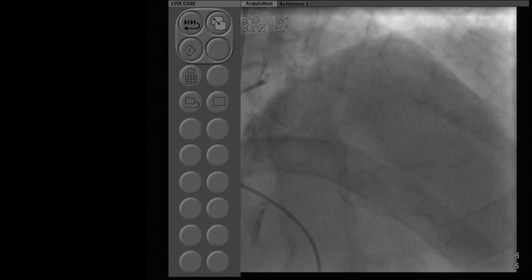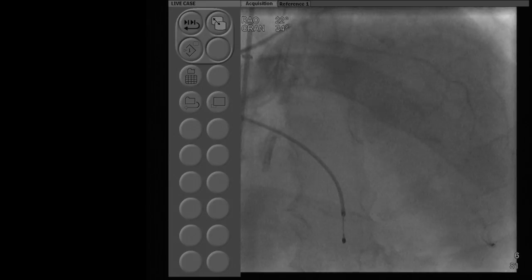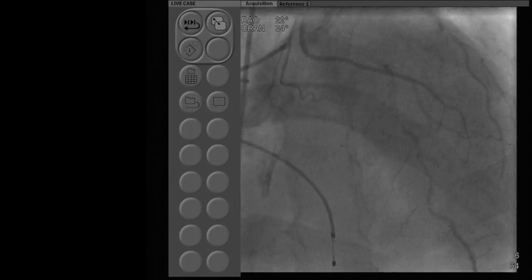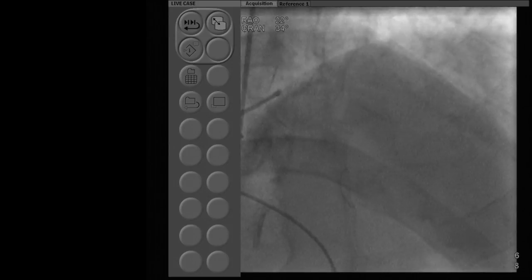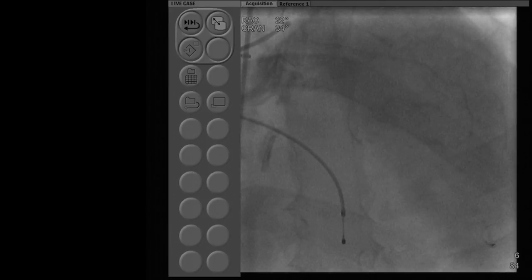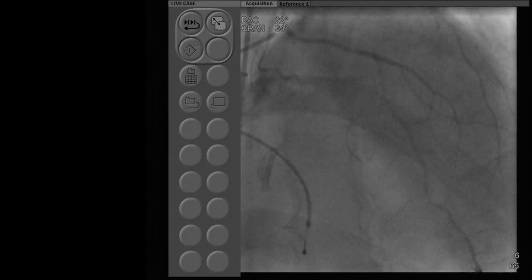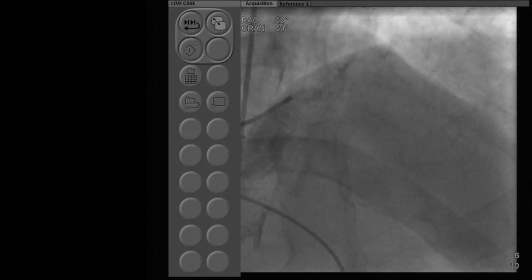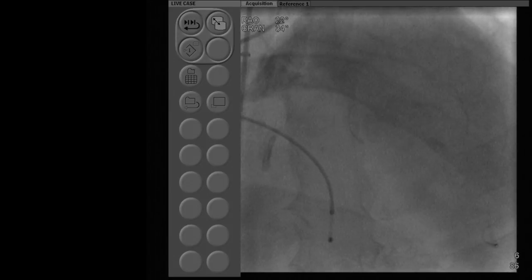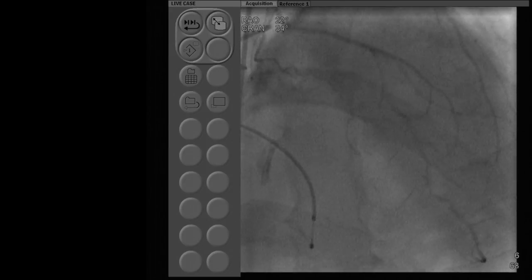Tell us about imaging, you wanted to do some imaging in this case? We were debating which imaging we wanted to do. We were ready for OCT, but once we did this angiogram, you see eccentric almost 95%, with some disease in the proximal LAD also, with some calcification. It's essentially a 1-1-1 bifurcation. And if you see the distal left main in this view, eccentric calcium almost subtotal, and because of that we were ready with OCT, but we are not going to do the OCT.